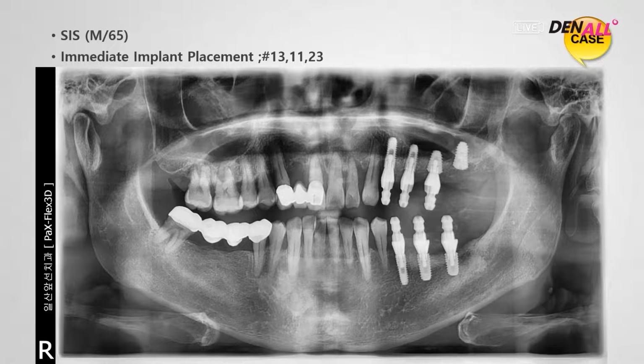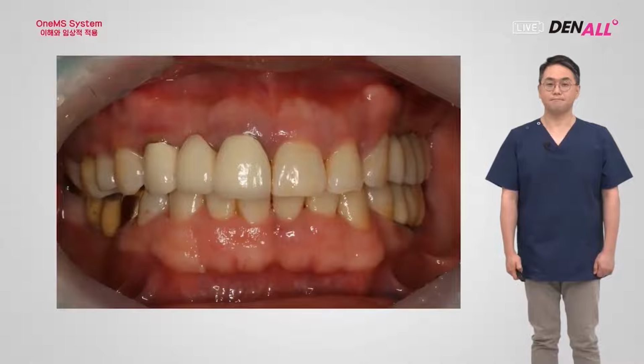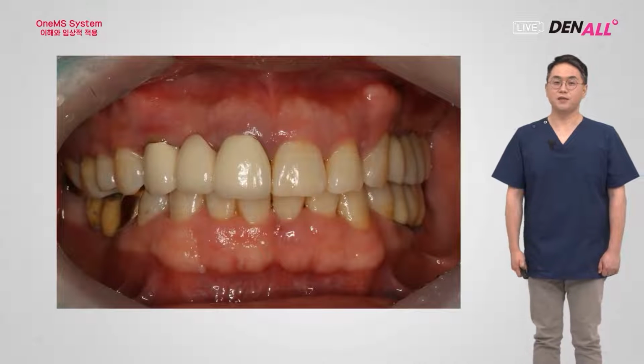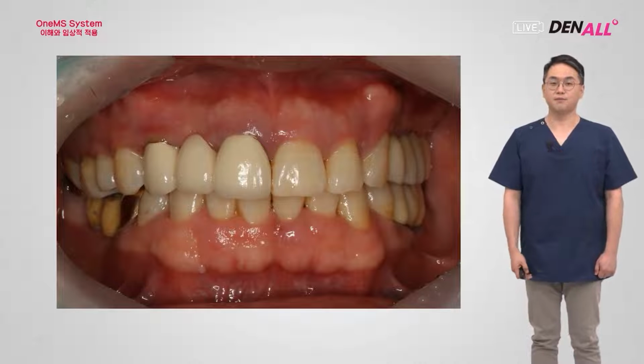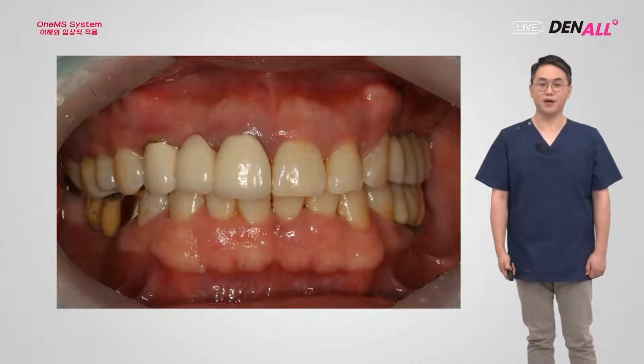On the upper part, 6 teeth were extracted and 3 implants were placed. But due to periodontal disease, there was mobility, and also on the right upper side, the prostheses were kind of shaky. This is the pre-surgery photo. Gingival recession or labial bone defect did not exist, so I planned for immediate implant placement.